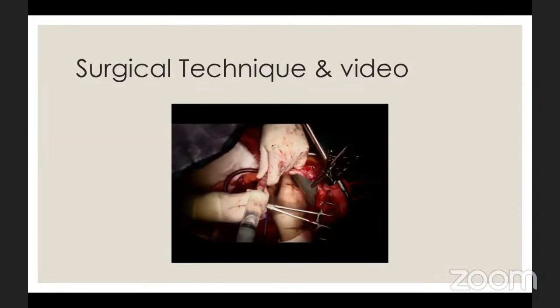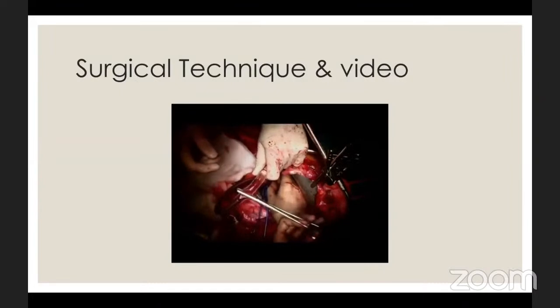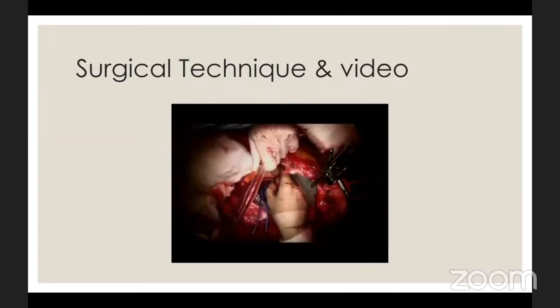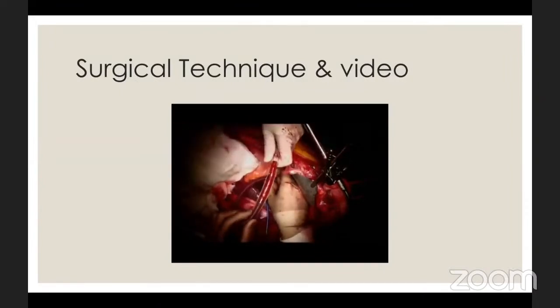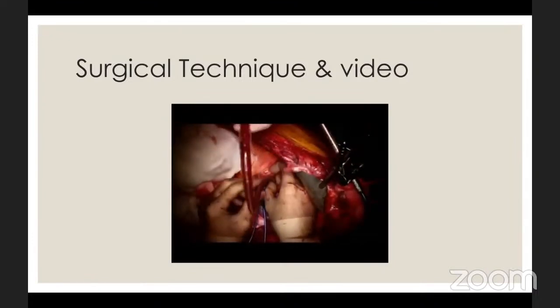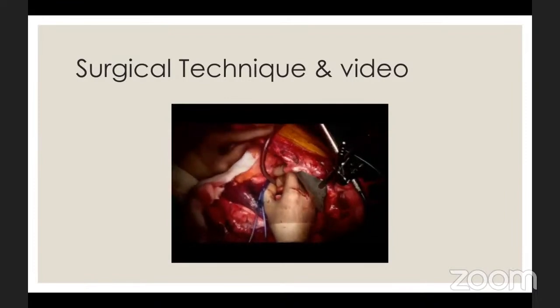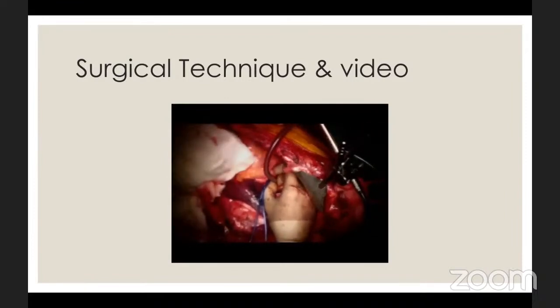The surgeon introduces and stabilizes the cannula into the initial position with the tip of the cannula directed toward the assistant. If the cannula is left alone, the tip may drift toward the mitral valve, causing unwanted cardiac problems. The cannula is fixed with sutures together with both tourniquets.